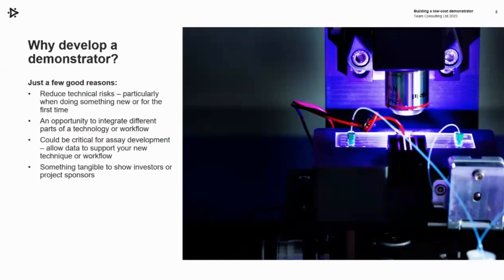The development of assays often take place in quite a different environment using standard lab equipment compared to what's perhaps envisaged for the integrated product. So early stage demonstrators provide an opportunity really to bring together parts of the workflow, test technology interfaces, and to start to understand some of the key elements of the control and detection systems. And that could be critical for the assay development itself, allowing data to support the detection technique or combining those workflow steps.